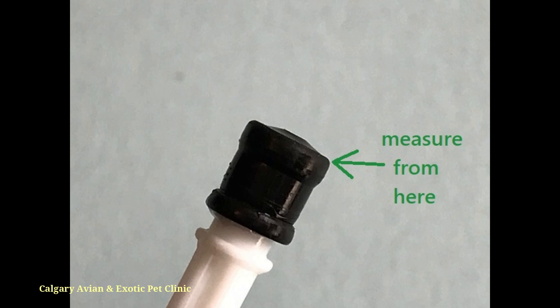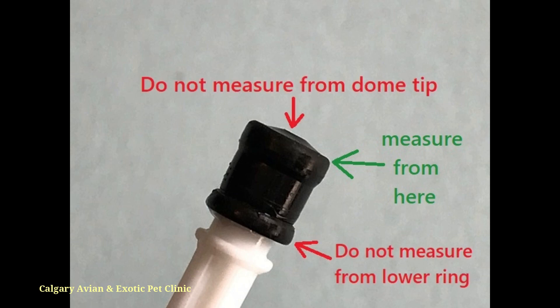At the end of the plunger, there is a rubber tip that is domed. To accurately measure the amount of liquid in your syringe, be sure to line up the top ring of the plunger tip with the proper calibration marking on the barrel. Do not use the tip of the dome or the lower ring of the plunger tip when reading the amount of liquid in the syringe.